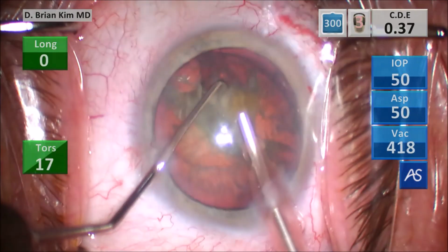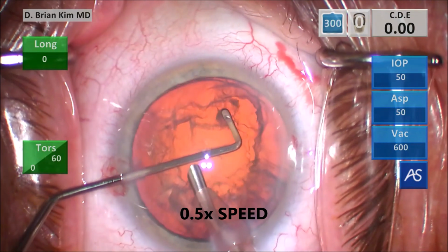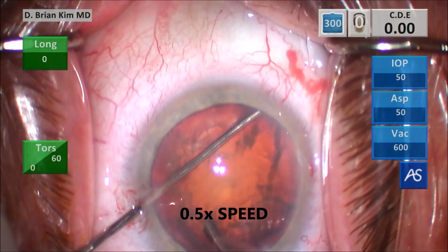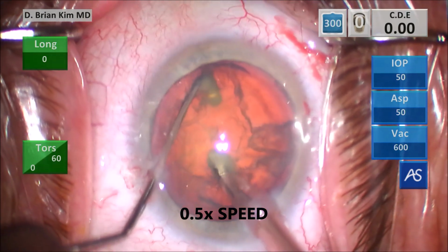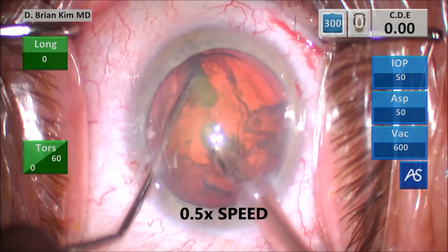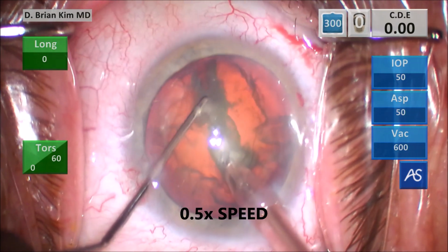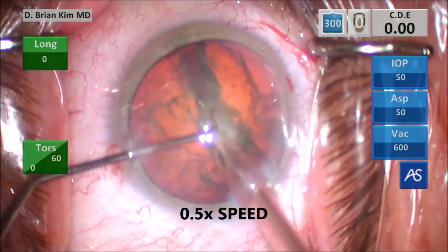And so you're going to see this again in half speed, pronating my hand, sliding the chopper underneath the rexis edge. I know that I'm there. I rotate the chopper vertically and it pops down into the capsular fornix. I rotate the phaco tip vertically subincisionally. You can see I'm able to engage the lens on both sides. I can feel the tactile feeling of that. I've gripped the lens on both sides. I bring the instruments together, compress the lens, and it fractures completely in half.